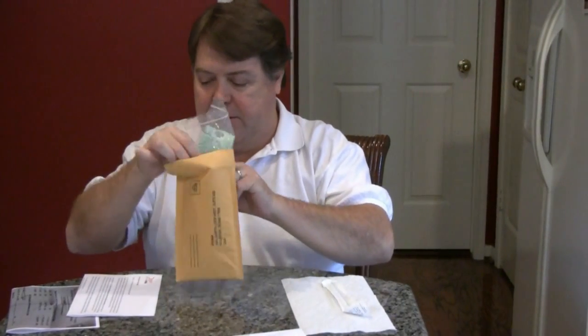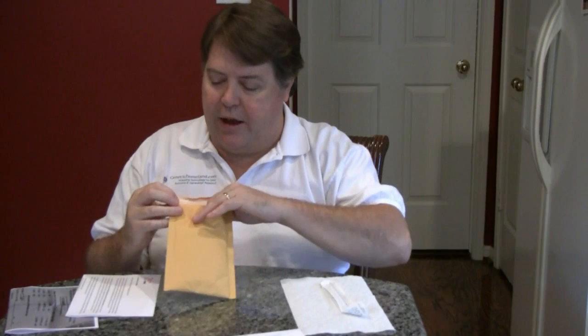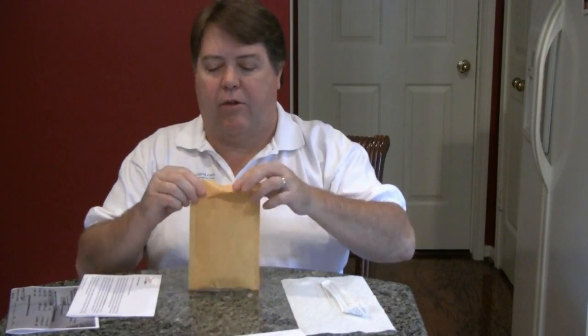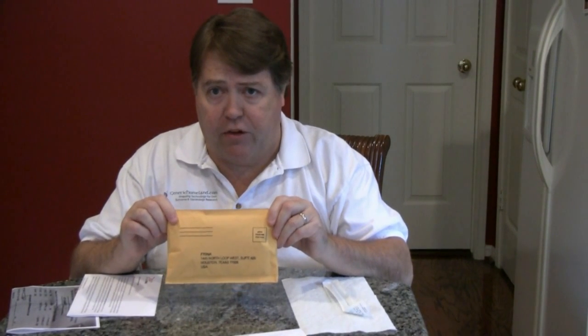Put it in the manila return envelope addressed to Family Tree DNA. If you have an order form, also be sure to put that in the envelope as well. It's got an adhesive seal label you can peel off to close it up. Put appropriate postage on it — Family Tree doesn't necessarily have the right postage for your country, so be sure to check what the appropriate parcel rate is. This is a parcel, not a letter. Mail it back to Family Tree DNA and you'll get your results online.